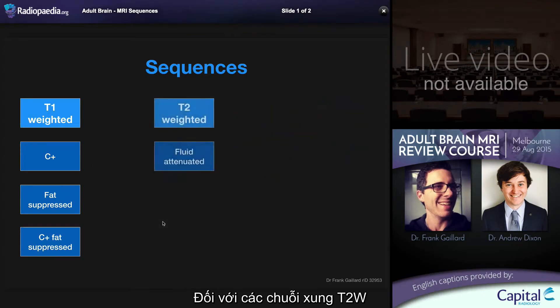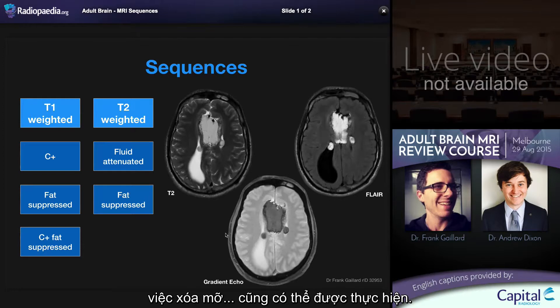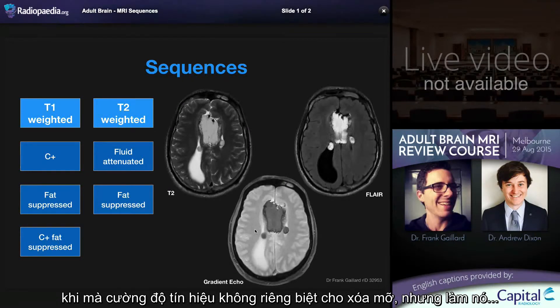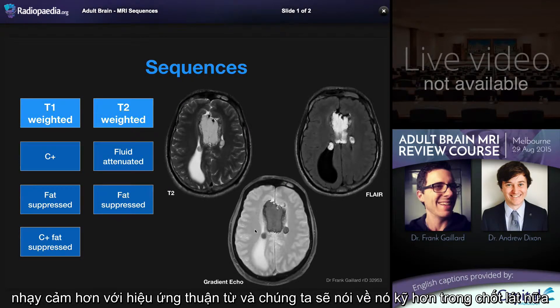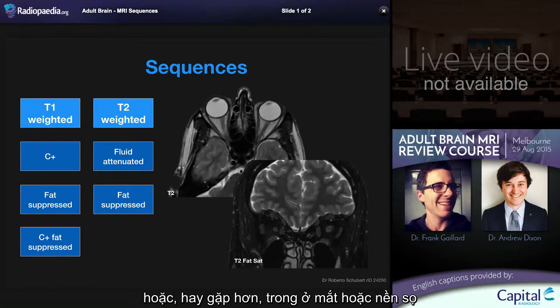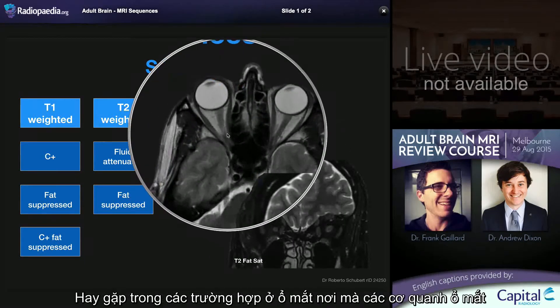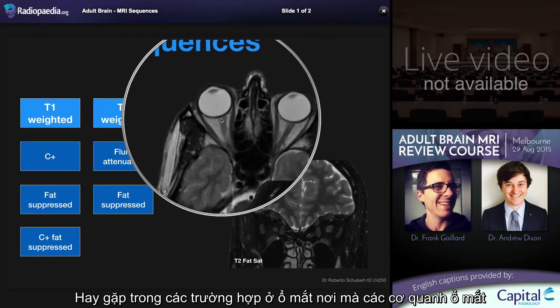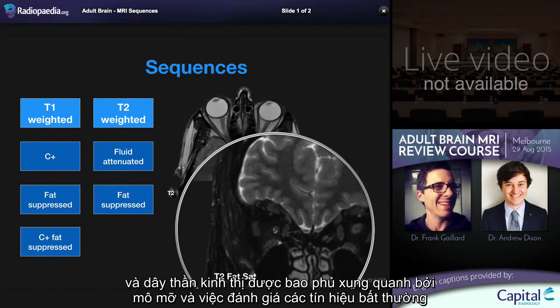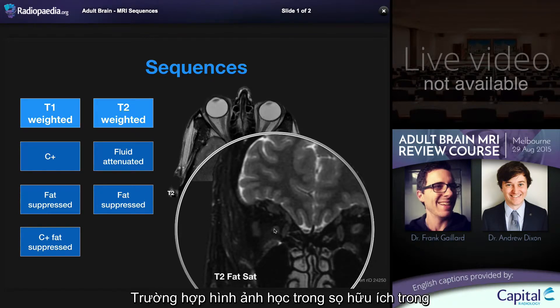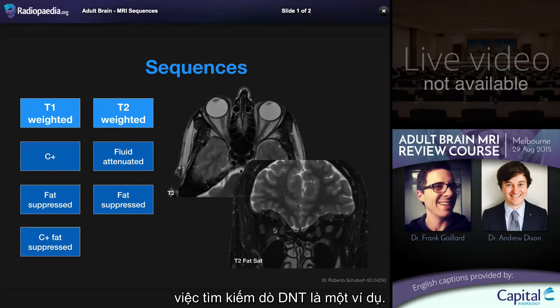Moving on to T2 weighted sequences, fat suppression can also be performed. This can be done as part of a gradient echo sequence where the intention is not particularly to fat suppress but to make it more susceptible to paramagnetic effects. More commonly, fat suppression on T2 is applied in the orbit or base of skull to examine structures otherwise closely related to fat. In the orbits, the extraocular muscles and optic nerve are surrounded by fat, and examining for abnormal signal within those structures is much more easily performed with fat attenuation. This would also be useful intracranially to look for a CSF leak, for example.